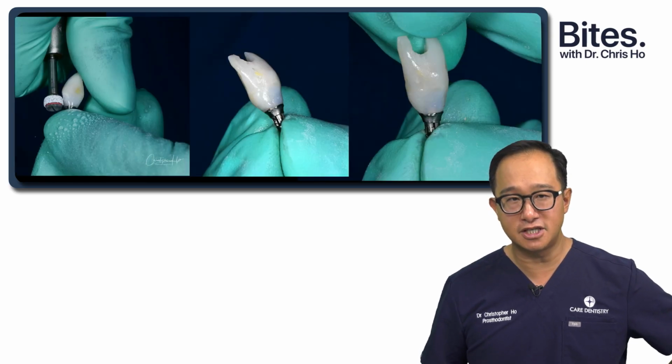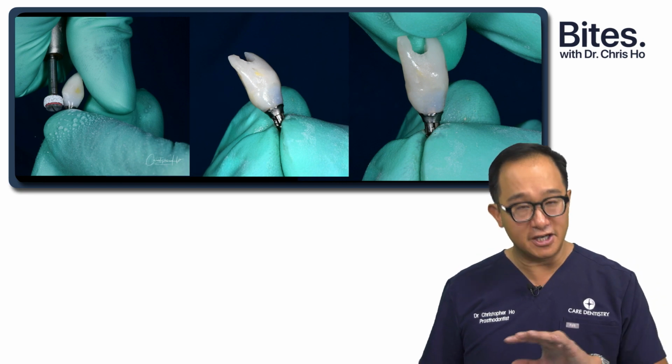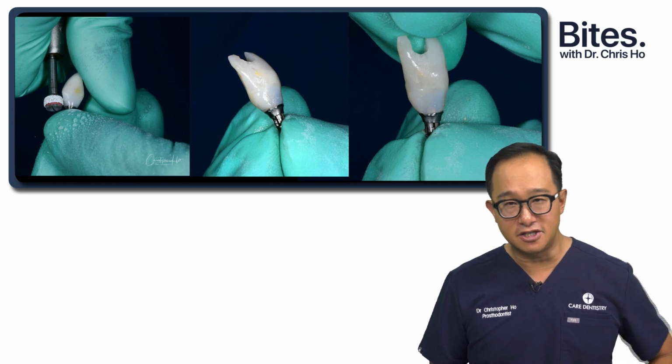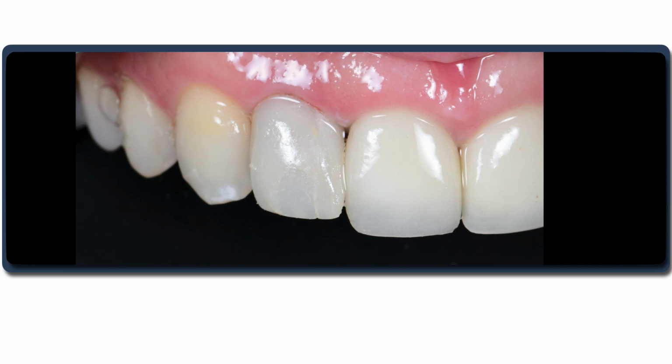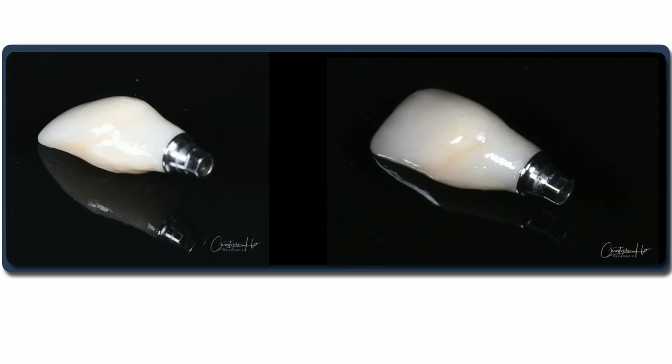We're going to change this by firstly under contouring the facial critical contour, and in the subcritical contour we've added a little bit of flowable composite resin to provide a little bump in that subcritical contour. So we've under contoured the facial critical contour, and we've put a little bump on the mesial to slightly push on the soft tissue. So you can see the provisional restoration, the day of me adjusting it, I'm pushing on the soft tissue, I'm under contouring the facial critical contour, and you'll see there's the final restoration with a little bump in the contours of the restoration.